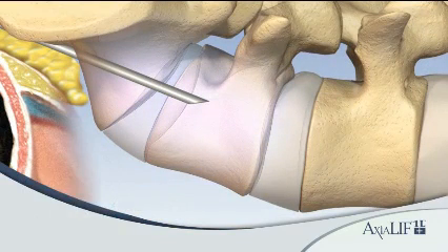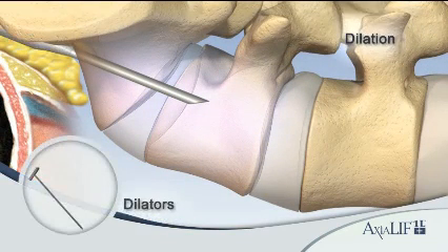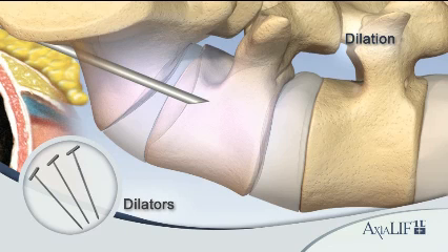Once the guide wire is engaged, use a series of sequential dilators to create a working channel. A dilator sheath is attached to the 10 millimeter dilator. The dilator sheath is left in the sacrum to create a transosseous working channel.